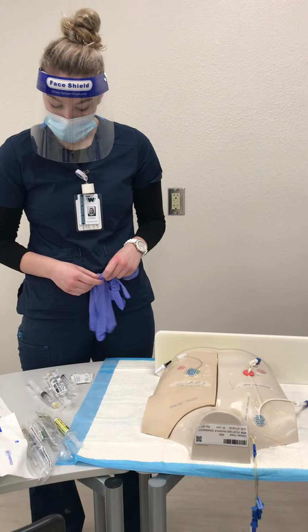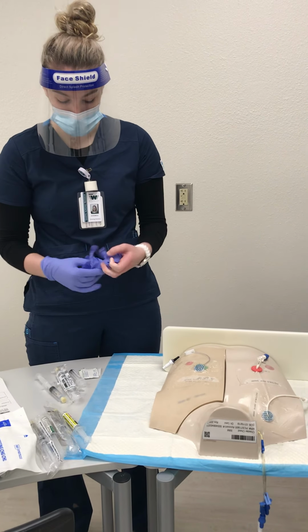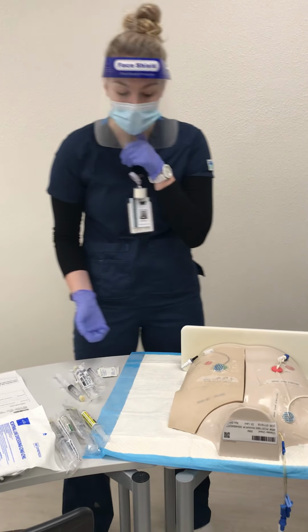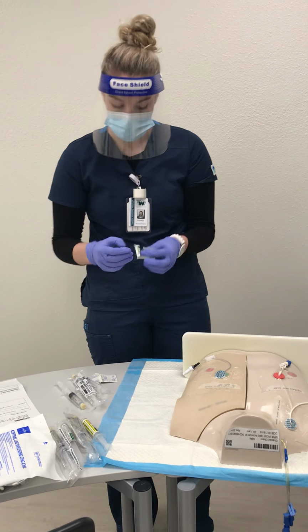So first I have to get a blood draw. The provider is requesting some labs. Do you have any questions about that? You don't? Okay. So I would have the lab tech with me so that she could take the sample.